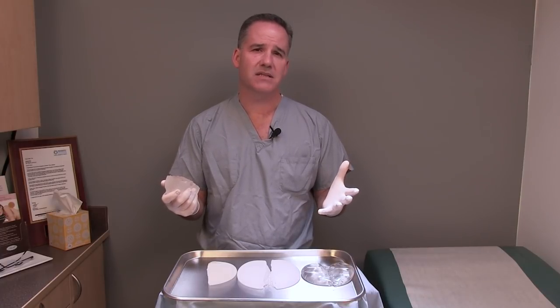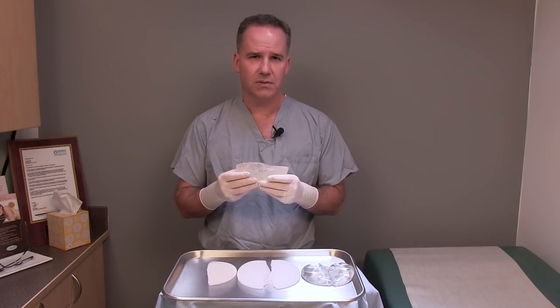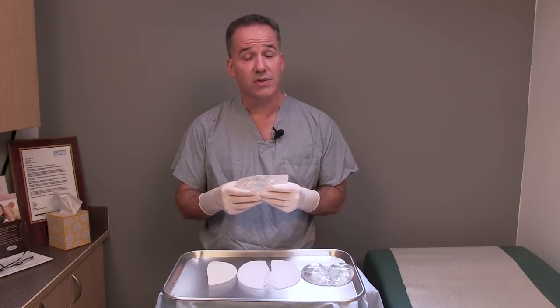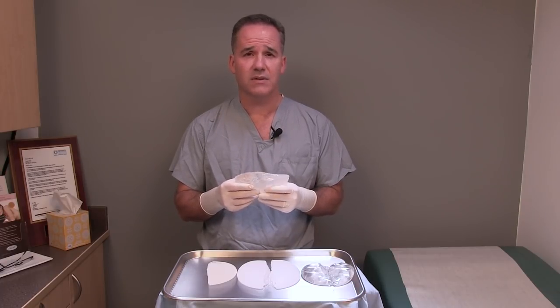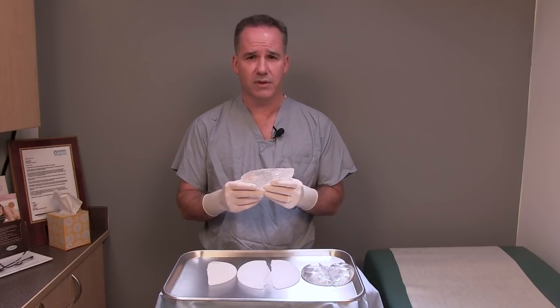I'm asking myself: if an implant like this was in my sister and I knew she had a rupture, would I really care? Of course I would go ahead and change it, but I don't think I'd be in a big rush to do that. I really don't think we need to be too worried about this type of implant having a rupture.